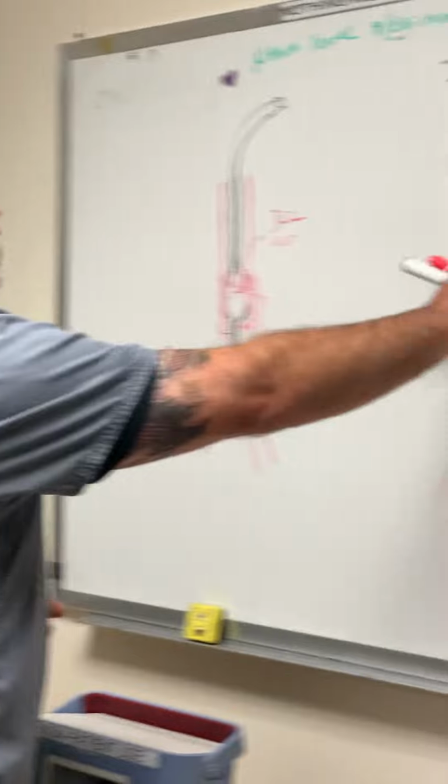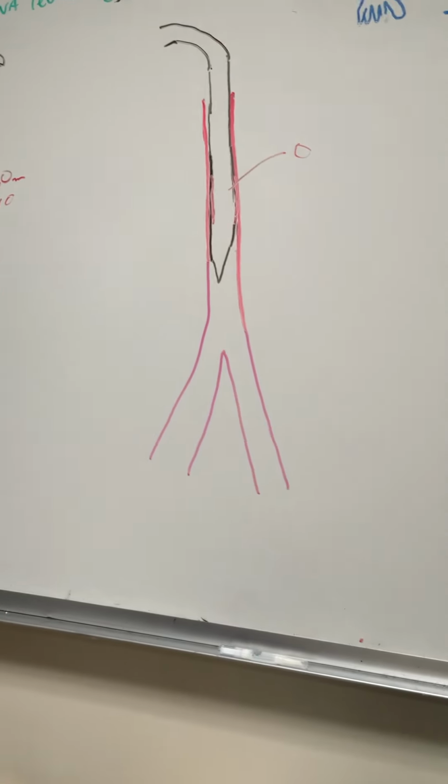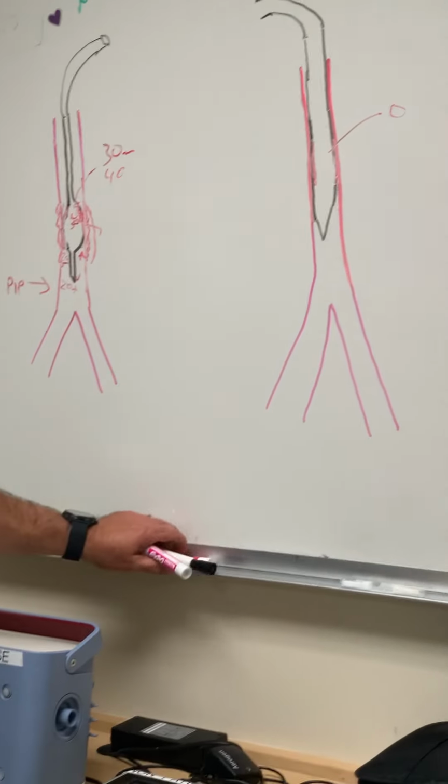We listen. We start with the listening. If we don't hear a leak in the anterior neck, but we have a leak on a waveform, now we know it's not the cuff that the leak is coming from. We can work our way through the circuit and the patient to find other leak areas. Okay, so how are we going to do this leak test typically? We're going to come over here and I have this mannequin.